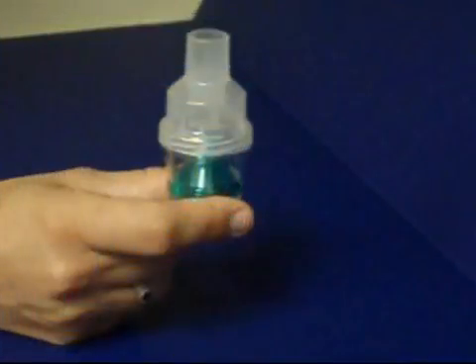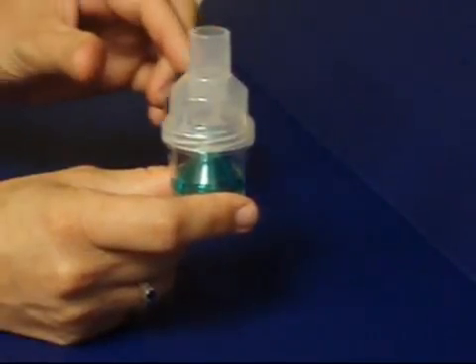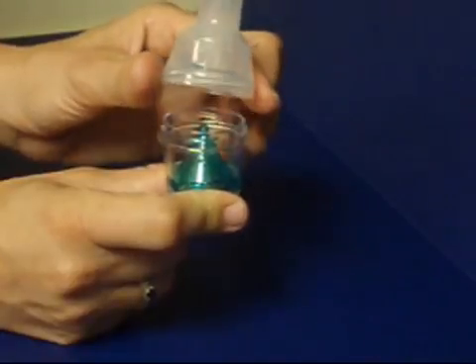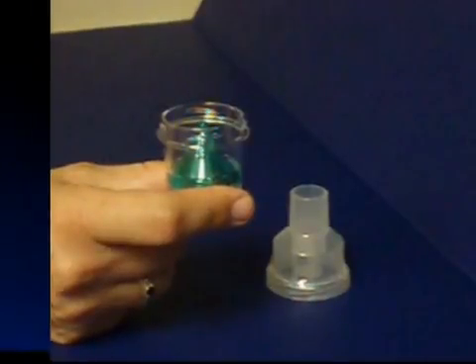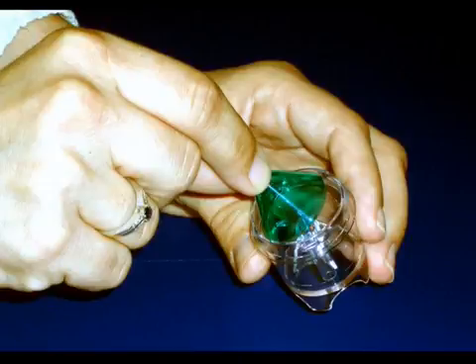Pick up the handheld nebulizer with one hand, grasping the clear bottom section of the unit. With your other hand, grasp the top, opaque part of the nebulizer and rotate the top in a counterclockwise direction. The top will disengage from the bottom. Set the top aside. Make sure that the green, funnel-shaped cone is securely in place in the bottom of the nebulizer unit with the small end of the cone facing up.